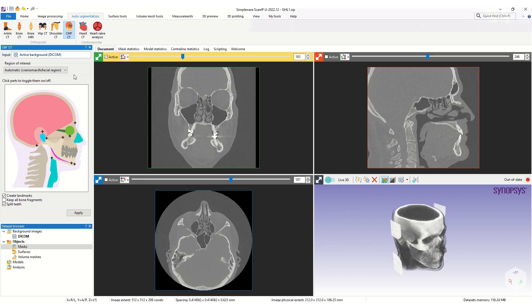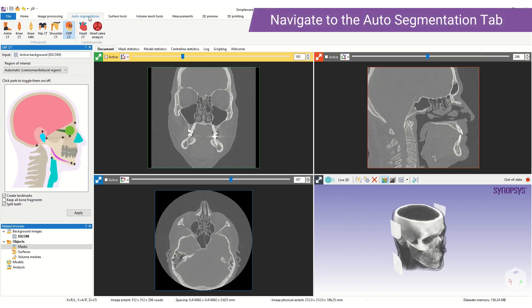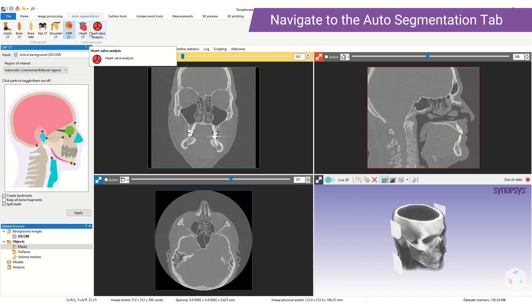To run the tool we navigate to the Auto Segmentation tab. This houses all of our AI-based Auto Segmenter tools. The tools are categorized into AS Ortho, our bone anatomy tools, and AS Cardio, our heart CT-based Auto Segmenter.